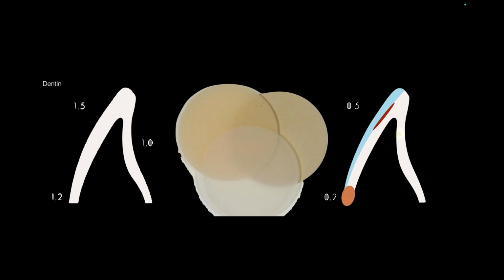One, I know everybody's going to be shaking their heads when I say this, your doctors usually don't prep enough away right in this incisal third. So I get it, I'm in the same boat. Prep guides, reduction copings are our best friends for these.